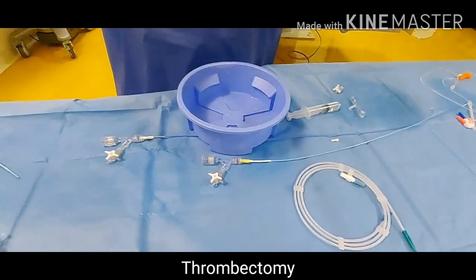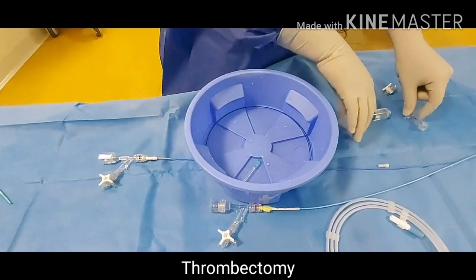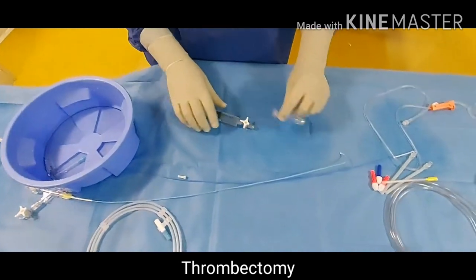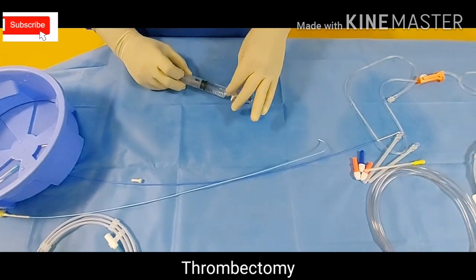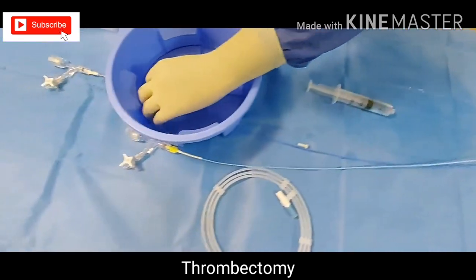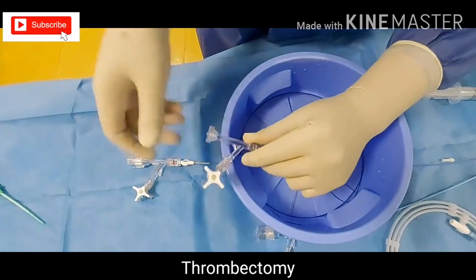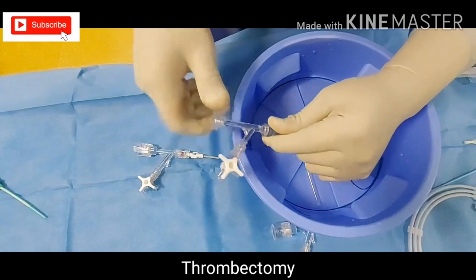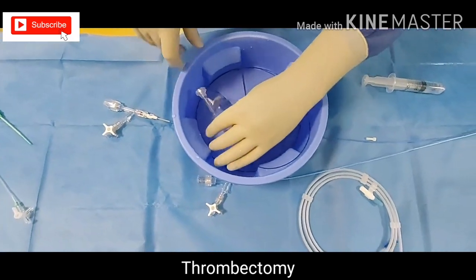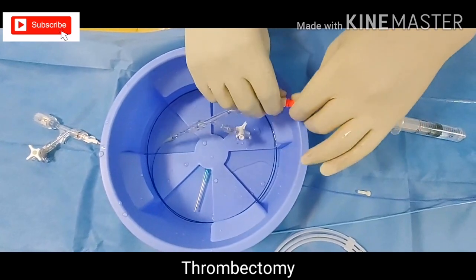Now it is ready. Until you use it, just make a loop and put it in your basin — there is a groove here for holding this catheter. Prepare a Y-connector for the micro catheter. Here we are using a screw-type Y-connector. The wire will go out like this — fix it well. This is the torque device; fix it and tighten it. If it is loose it will fall down.